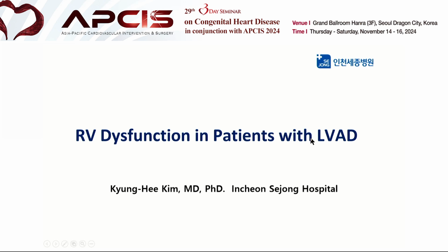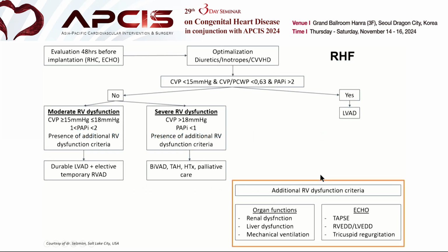I will be discussing RV dysfunction in patients with LVAD. I'd like to introduce two cases of LVAD patients who experienced LVAD failure. I'm outlining the approach for evaluating and managing RV failure in patients before and during LVAD implantation.